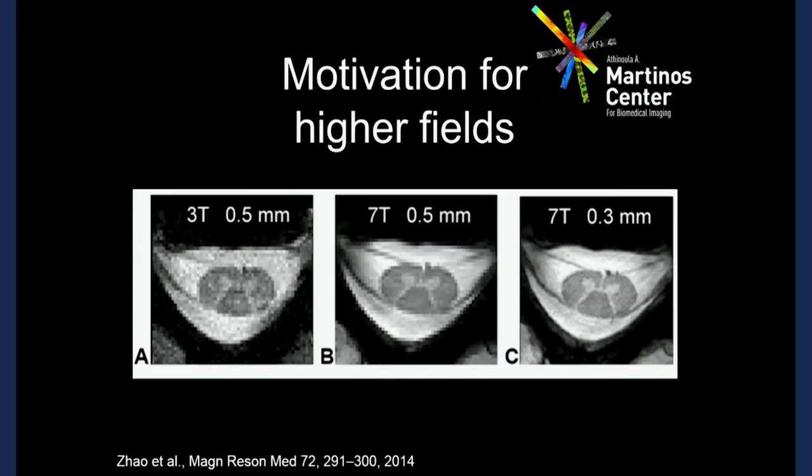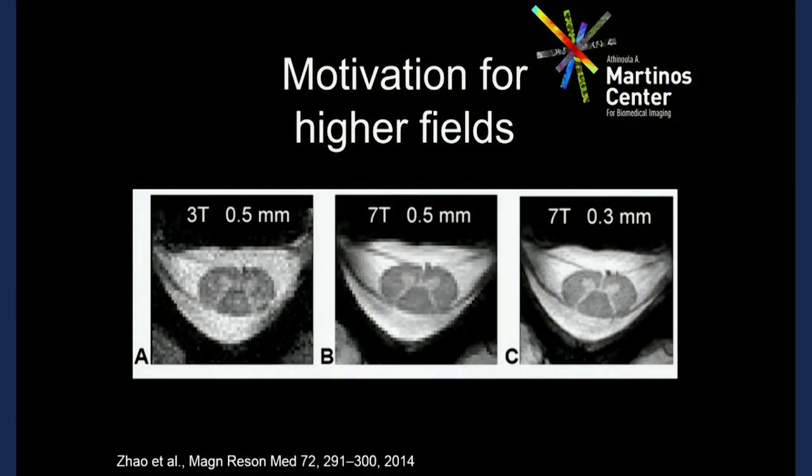Remember those fuzzy pictures that previous presenters showed you, where they kind of had to say, well, this fuzzy blob in the middle is a spinal cord. At higher fields, you can not only clearly resolve the spinal cord, but you can actually start to see structures within the white matter, structures within the gray matter. You actually start to see the little prongs on the ventral horns. That's the top part there. So this is phenomenal. Now, unfortunately, there's only a few of these centers in the world.